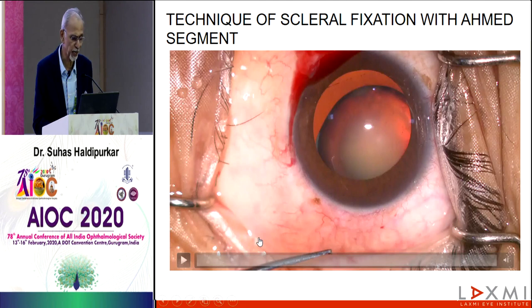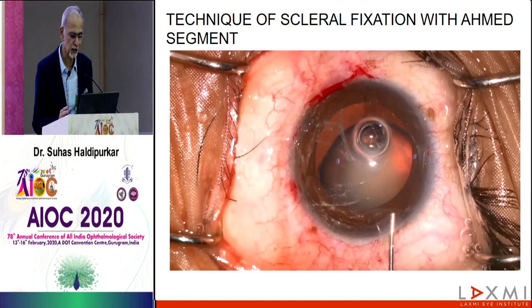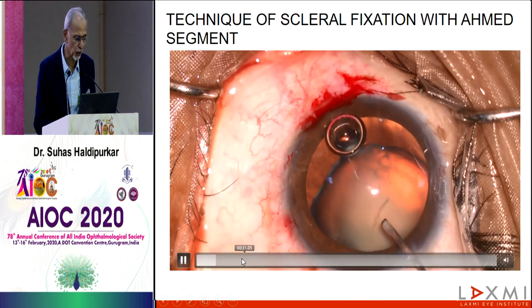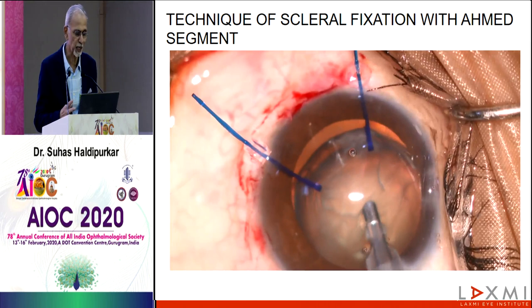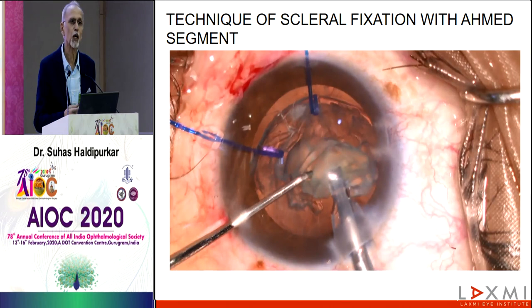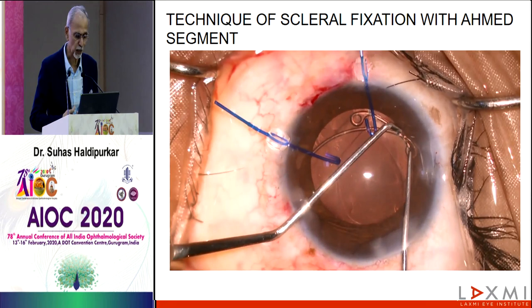Now, this is an extensive weakness and subluxation where there's vitreous as well in the anterior chamber. First thing you do is to do anterior vitrectomy, start your rexis away, and then, even before anything else is done further, do a copious hydrodissection, free the nucleus from the bag, and if possible, free the epinucleus and the cortex from the bag, and put in your hooks. And after that, maybe this is a stage when you do a rehydro and then put in your endocapsular ring.